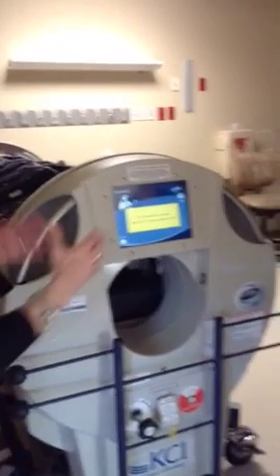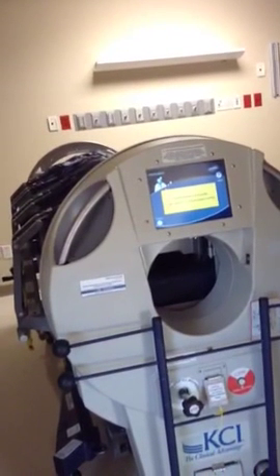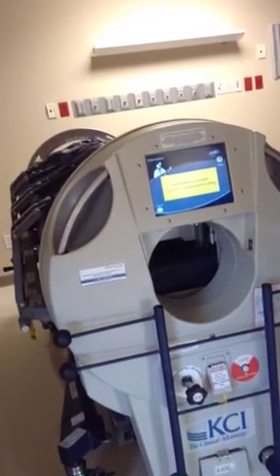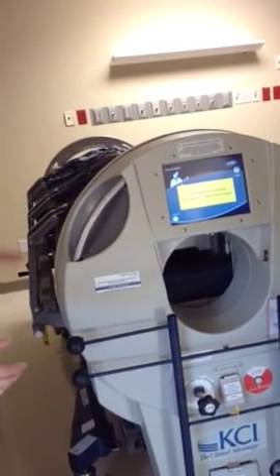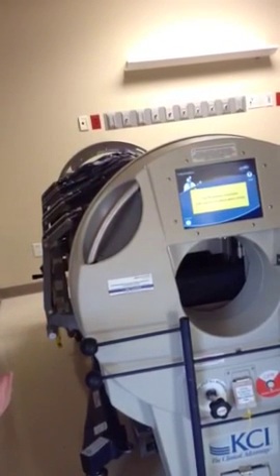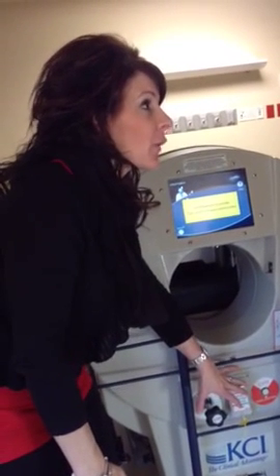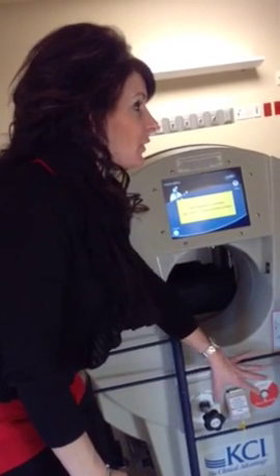Lastly, the patient is over and you have had to use the manual proning lever, or you have a power outage or something breaks on the circuit board and you manually have to turn the patient over. Historically, you couldn't do that. It's stuck at 62 degrees and you had to swap the unit out. Now we have this switch in here that overrides the machine locking you out.